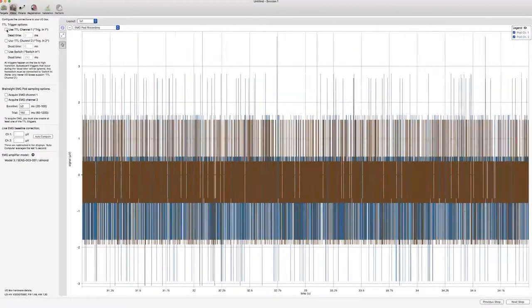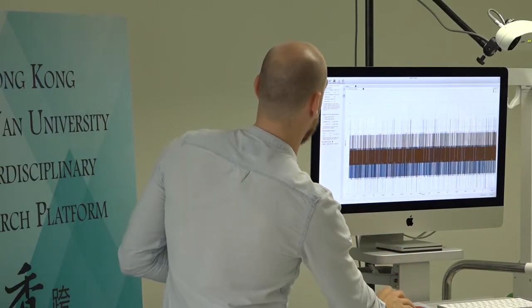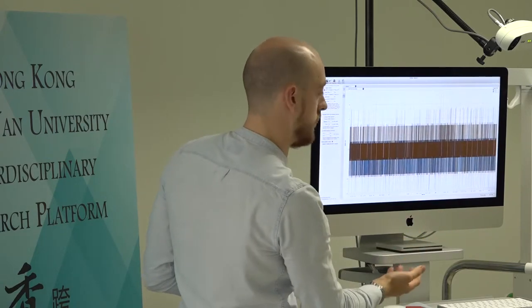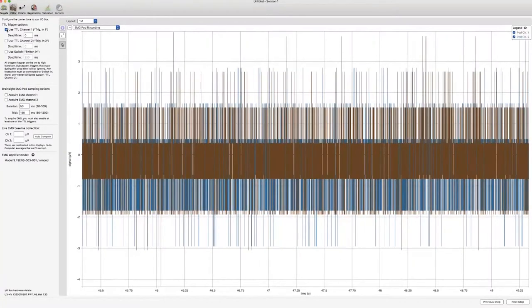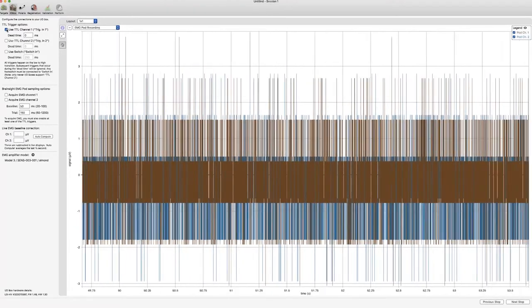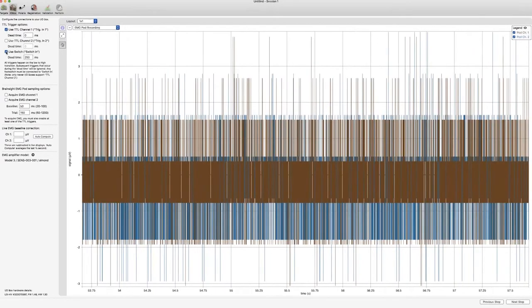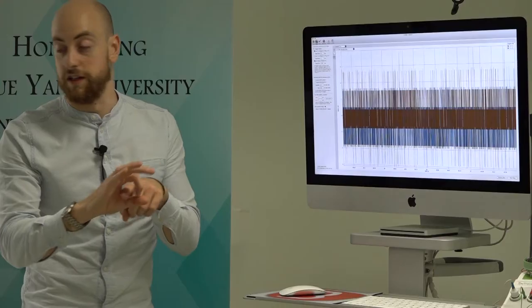But because we're using the stimulator to trigger BrainSight of when to capture that sample, you always want to make sure that if the stimulator is coming in on TTL1, then you turn TTL1 on, because that will tell BrainSight to listen to what the stimulator is doing. Every time you click the button or send a pulse on the coil, BrainSight will capture exactly where the coil is. And again, you can use the switch there, depending on the input you're coming in on.